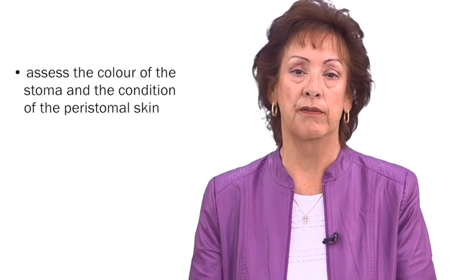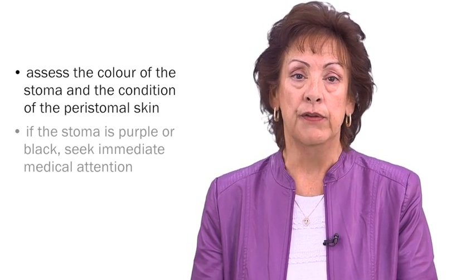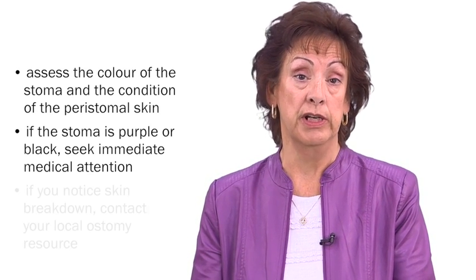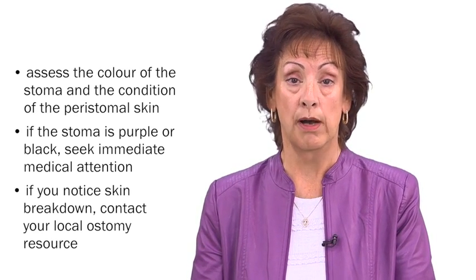Always assess the color of the stoma and the condition of the peristomal skin. If the stoma is purple or black, please seek immediate medical attention. If you notice skin breakdown, please contact your local ostomy resource.